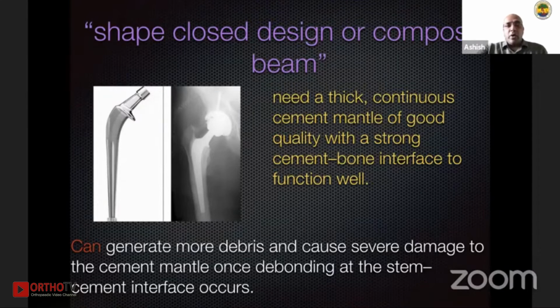However, what is important is that if it is not done well, because the surface finish is matte, it can generate more debris, it can cause severe damage to the cement mantle, and if debonding occurs, then this stem can loosen drastically because there could be a lot of stress and strain at the cement and stem interface. So what it means is that these matte finish stems are very good for the cement to stick on.